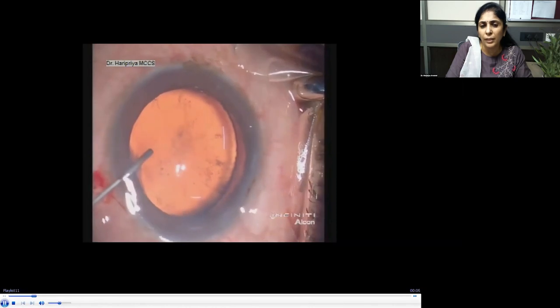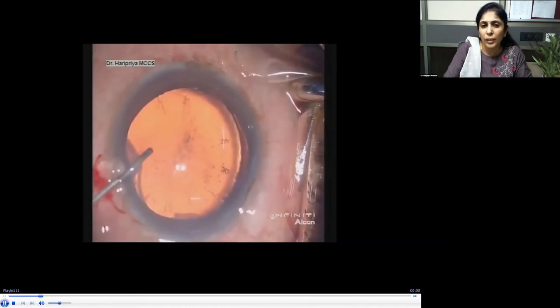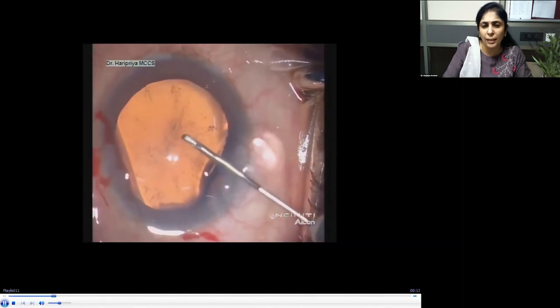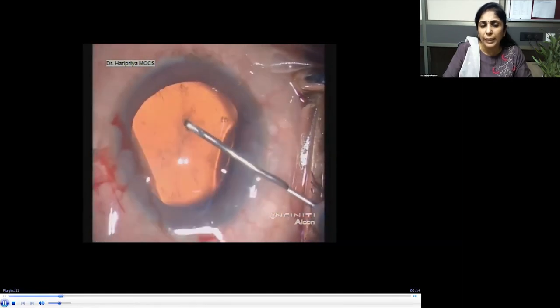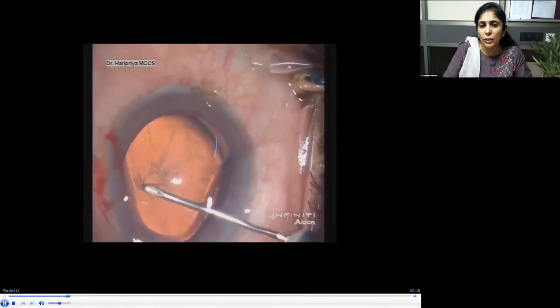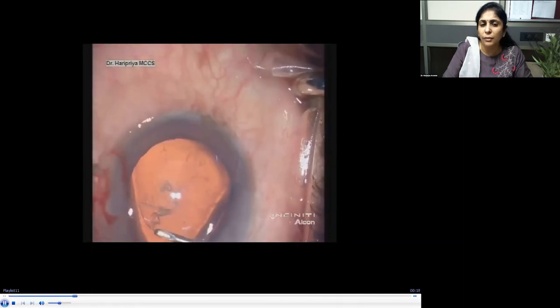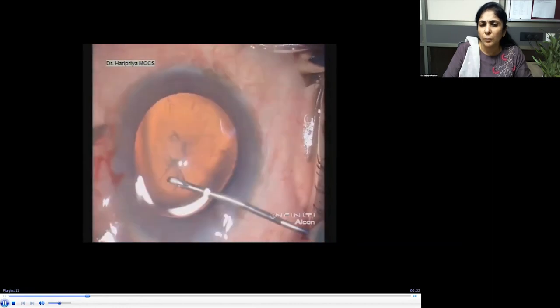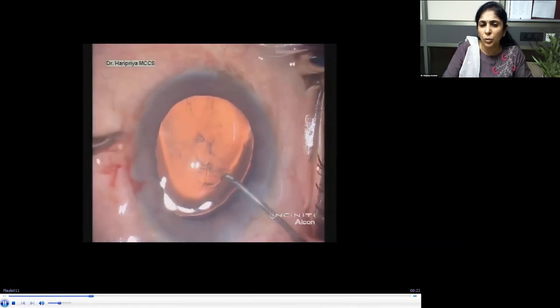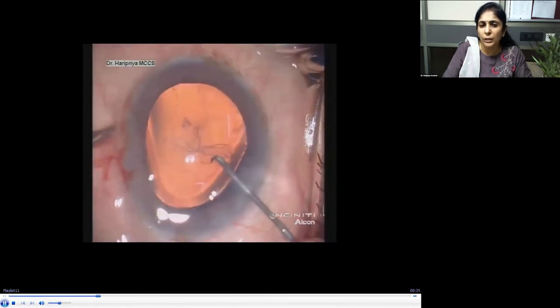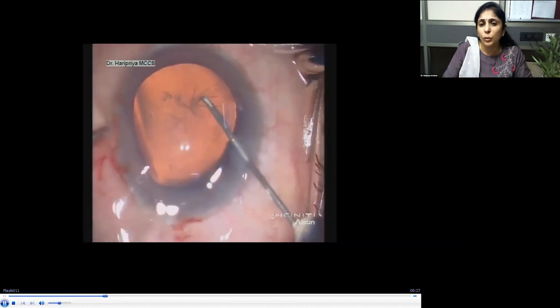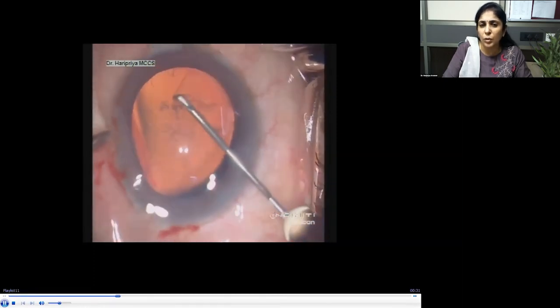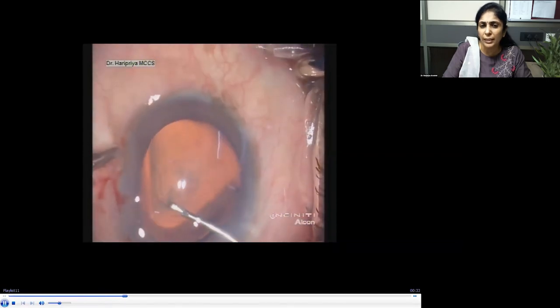This patient has more than six clock hours of dialysis. I'm injecting high molecular weight viscoelastic through the side port and trying to push the lens down — there's a little tilt here. The rhexis, as mentioned, is started at the site away from maximum zonular loss. Don't make it too small — you need working space — but making it too large risks extension. You want to find just the right balance.